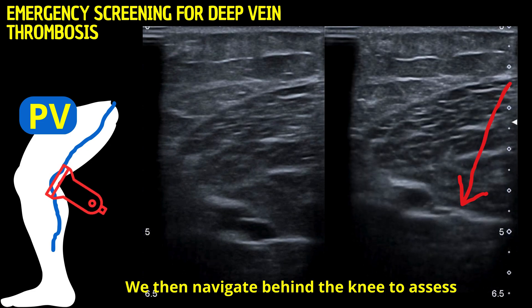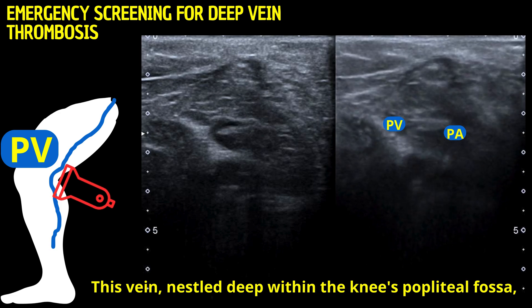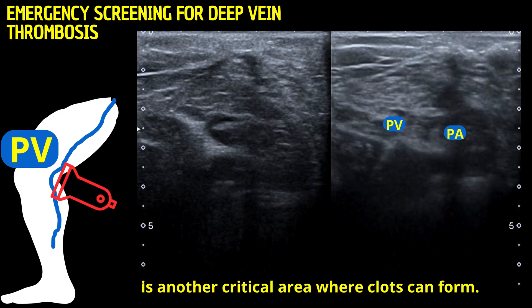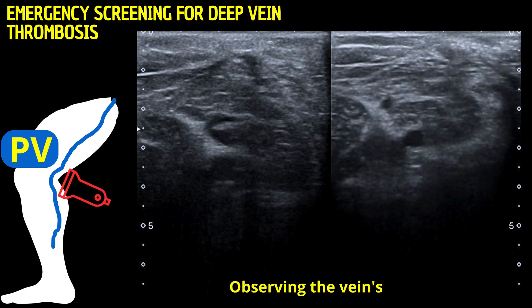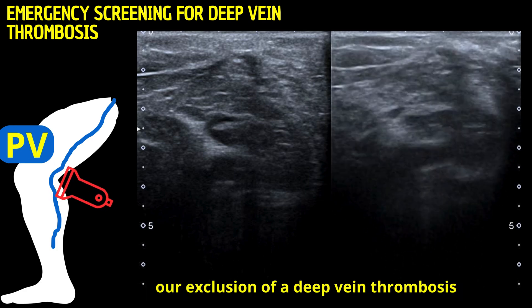We then navigate behind the knee to assess the popliteal vein. This vein, nestled deep within the knee's popliteal fossa, is another critical area where clots can form. Observing the vein's response to compression helps us to continue our exclusion of a deep vein thrombosis.